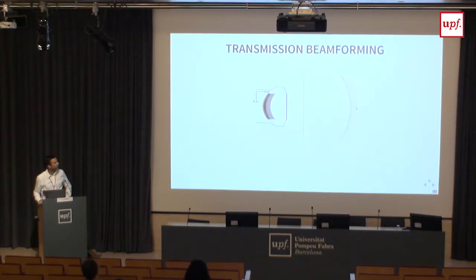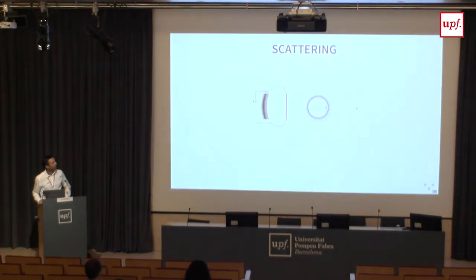And the reason why this is important is because when you have, say, a particle and you want to make a picture which shows where the particle is, if you focus your wave adequately, both laterally, so you choose the right sort of line that goes by the particle, then you will receive a strong echo back, and then you can have a nice picture.